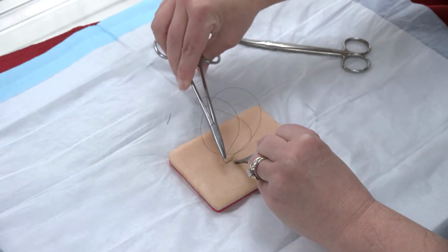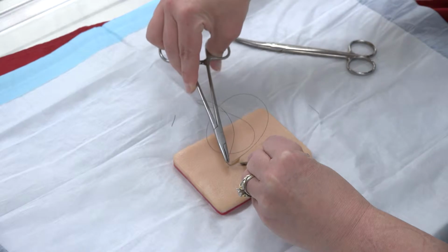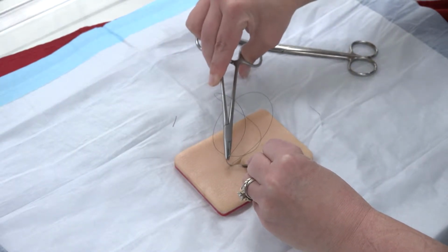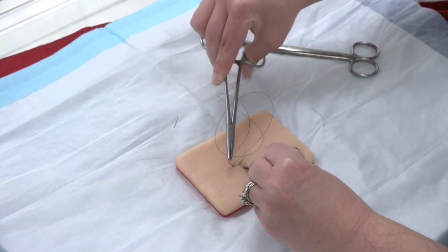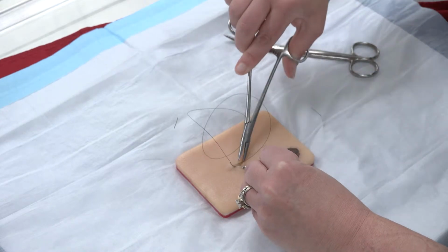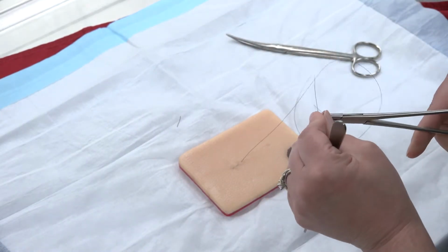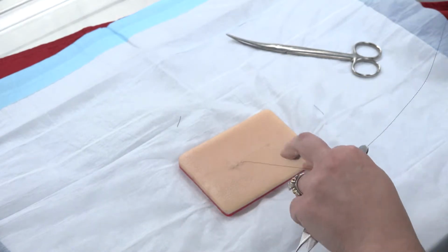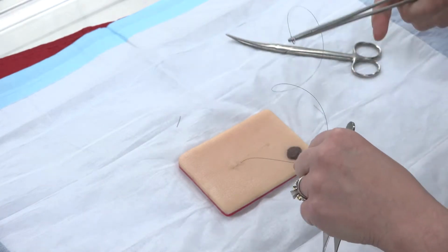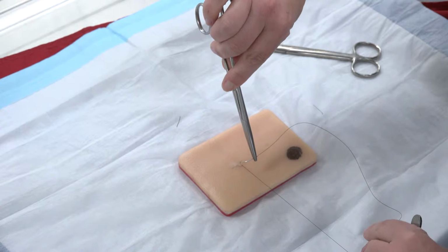If you pick up the subcutaneous tissue, in this suture pad it's hard to show you, but if you pick up the subcutaneous tissue or the junction between the subcutaneous tissue and the dermis, you can stretch this skin out a little bit and have an easier time putting it right where you want it. Okay. And then the other method is that you can still do it vertical. So you can do superficial to deep, deep to superficial, superficial to deep, deep to superficial, all the way along as well. That's the other way you can do it.